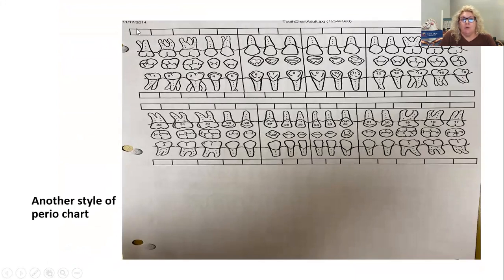Notice that the box is wide open. So I am required to write 3 numbers in this open slot for tooth number 1. And this would be the buccal. This is the lingual. And this is the mandibular arch. This again would be the lingual. And then this is the buccal. Just like on your charts when we're charting. Okay. Buccal, occlusal, lingual. Lingual, occlusal, buccal. Just like on your charts. And don't forget distal. We got the middle or mid number and then the mesial number.